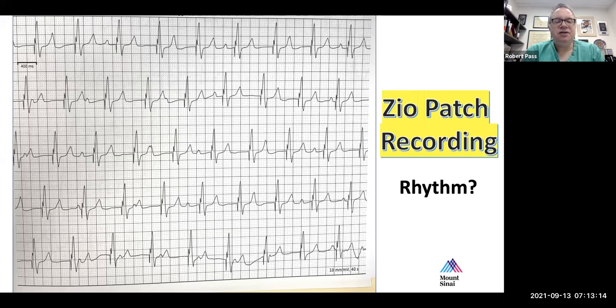About a year ago, Josie and I upgraded somebody from an abdominal implant to a transvenous system in the shoulder, and we turned on rate responsiveness, and the patient couldn't stand it because he had never had so much variability in his heart rate before, and he made us turn it off because he couldn't take it. He was so used to having a very stable rhythm without much variability. So this is VVI pacing at a rate of 70 in somebody with complete heart block.